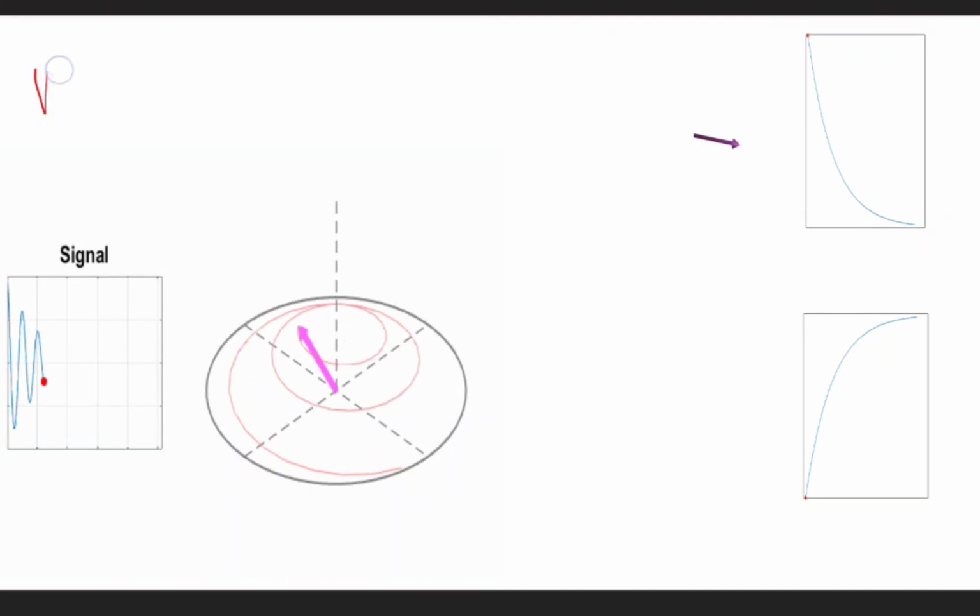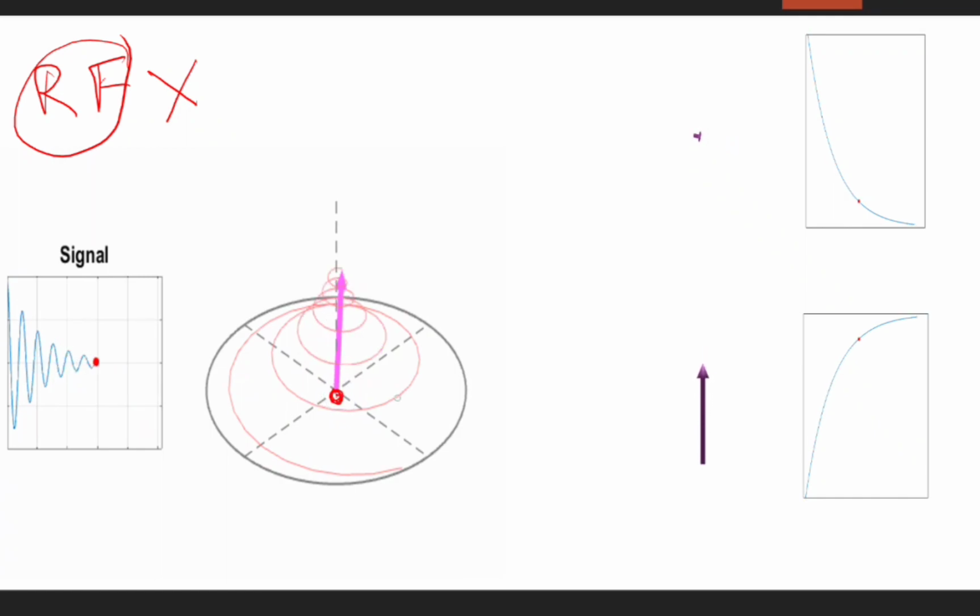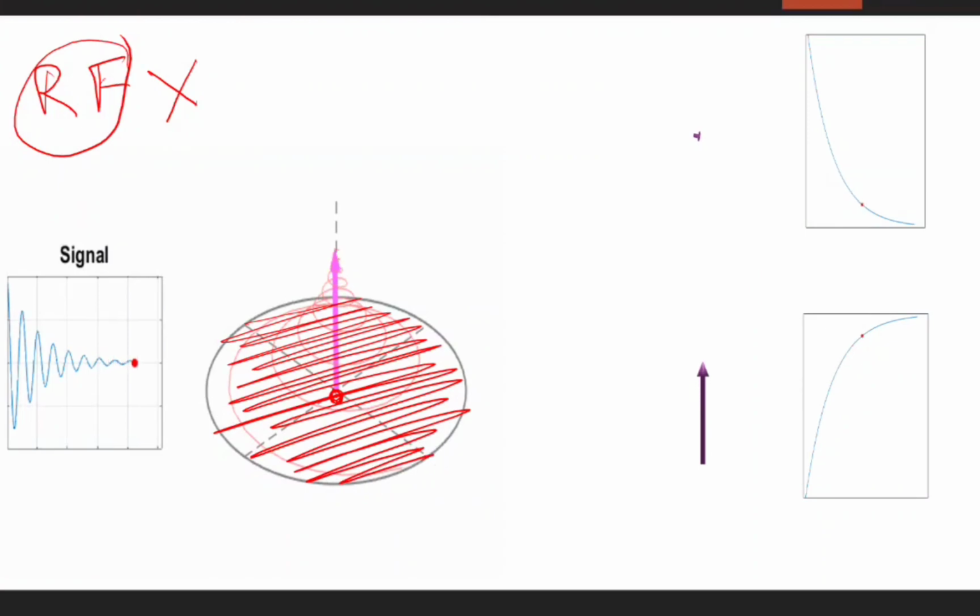So now the RF is off, no RF is supplied, we removed the RF. So what is happening, see, this is my plane, so from this plane it's going and my atom is going up. To explain this to you, I am making one vector here. This is the hydrogen atom. So we gave RF. This is the main magnetic field B0.